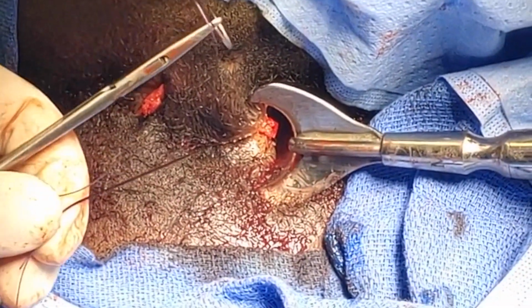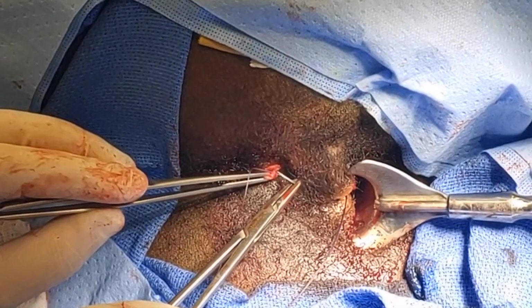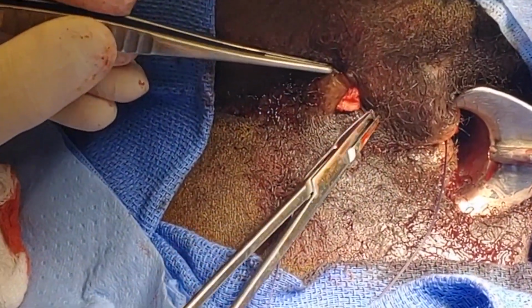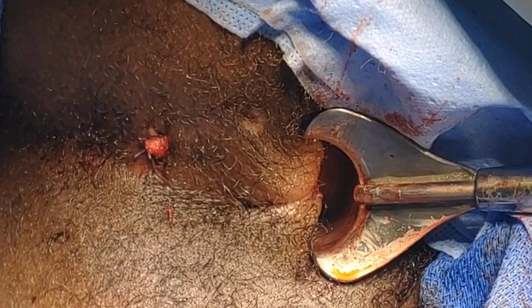The external opening is not closed, but rather simple interrupted Vicryl sutures are placed through the implant and into one side of the external opening wall. This allows for drainage to pass through while the fistula is healing. The final configuration is shown here.